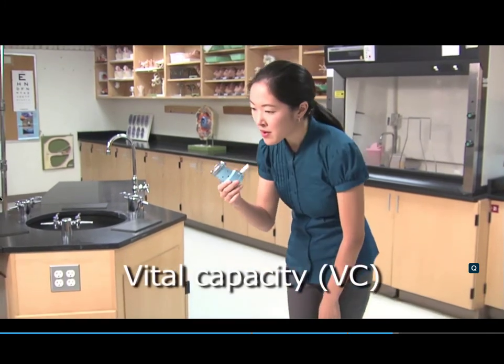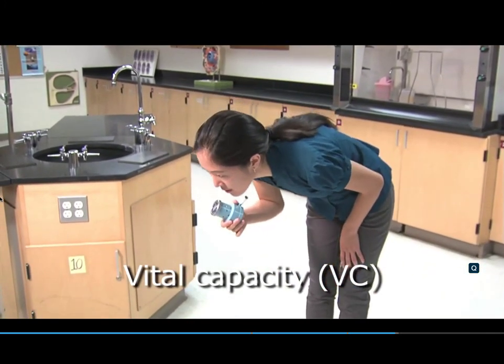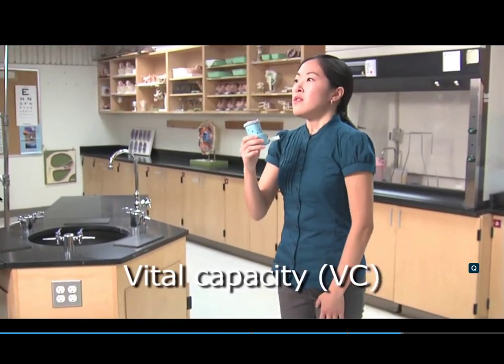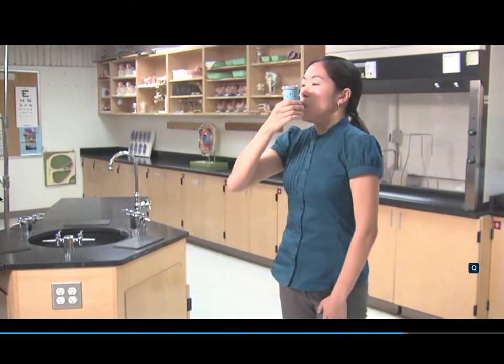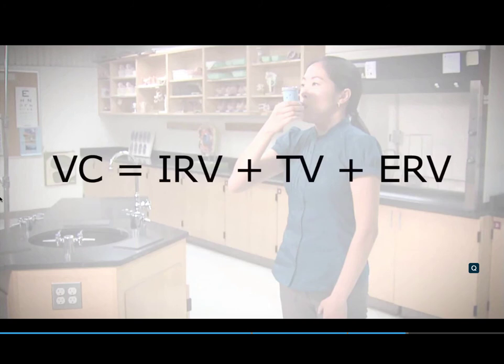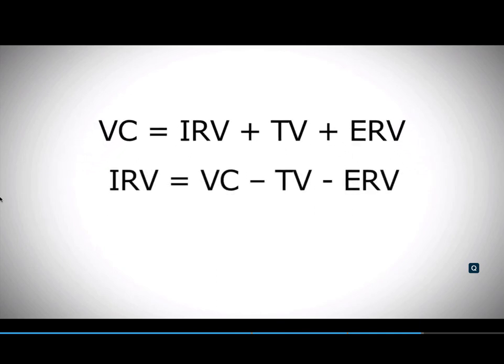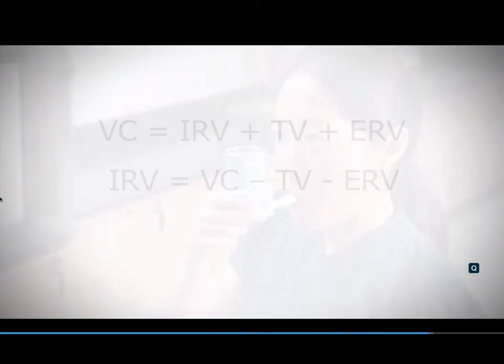The vital capacity is measured by inhaling as fully as possible prior to exhaling completely and evenly into the spirometer. Recall that vital capacity is the sum of inspiratory reserve, tidal, and expiratory reserve volumes. To calculate the inspiratory reserve volume, we rearrange the equation to see that inspiratory reserve volume is the same as the vital capacity minus the tidal and expiratory reserve volumes.